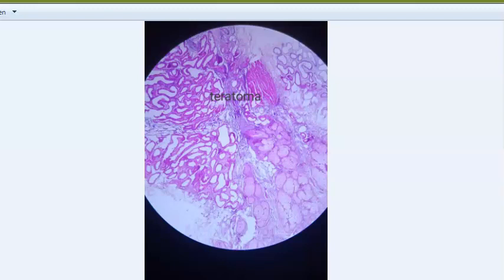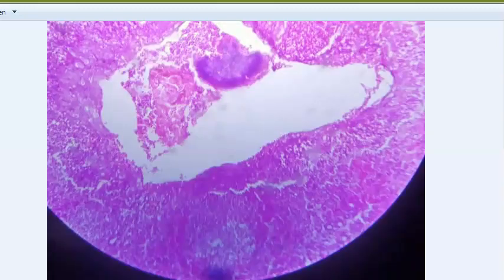Teratoma can also be monodermal, which is specialized - like struma ovarii. A classic example is a dermoid cyst of the ovary. Structures you can find in a teratoma include sebaceous glands, sweat glands, hair follicles, cartilage, bone, respiratory epithelium, and intestinal epithelium.